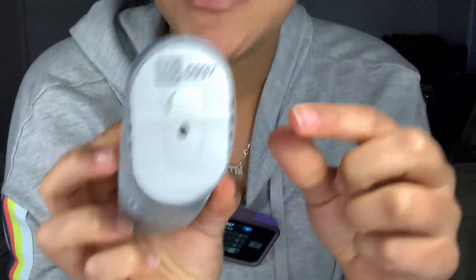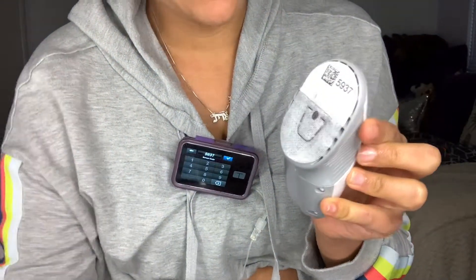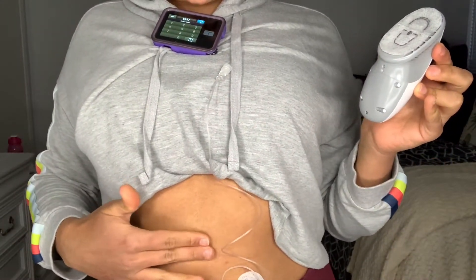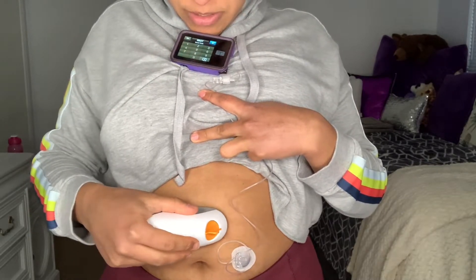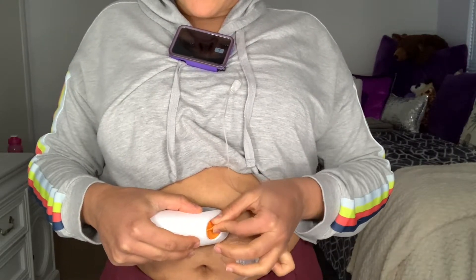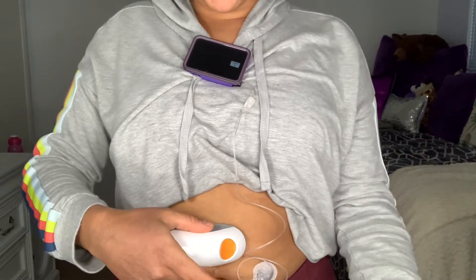Now I'm going to take my sensor out of the applicator. We already put the code in our pump, so we're good with that. Now we're going to take the sticky backing off — make sure the spot we're going on is a little sticky, which is the whole reason we have that skin prep. Then we're going to put it exactly where we want it and press it down. We're going to take this orange safety cap off — this is so you won't accidentally press the launch button before you're ready.